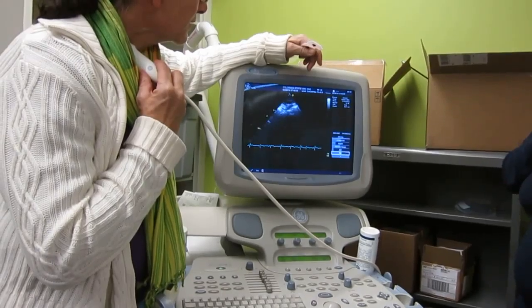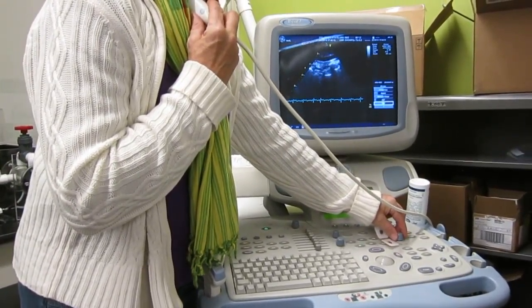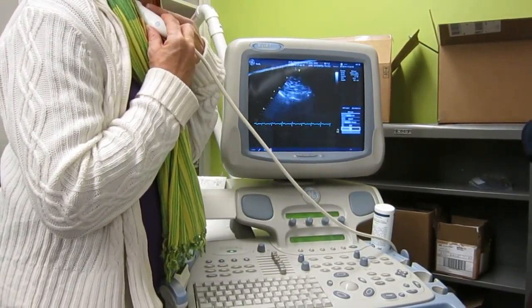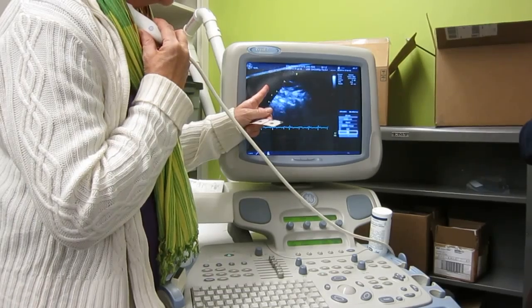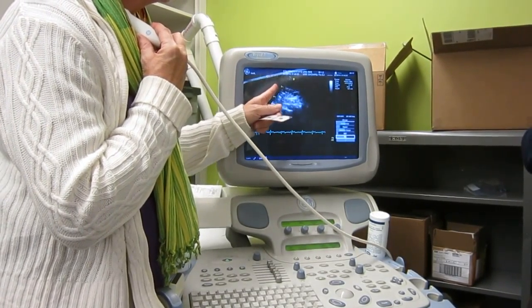Okay, can I find a vessel? Let's stick with this. There's a vessel. Okay, so because I've got the light pointing up, this is cranial, and this will be caudal. I don't find any plaque, huh? Does that make sense? Okay.